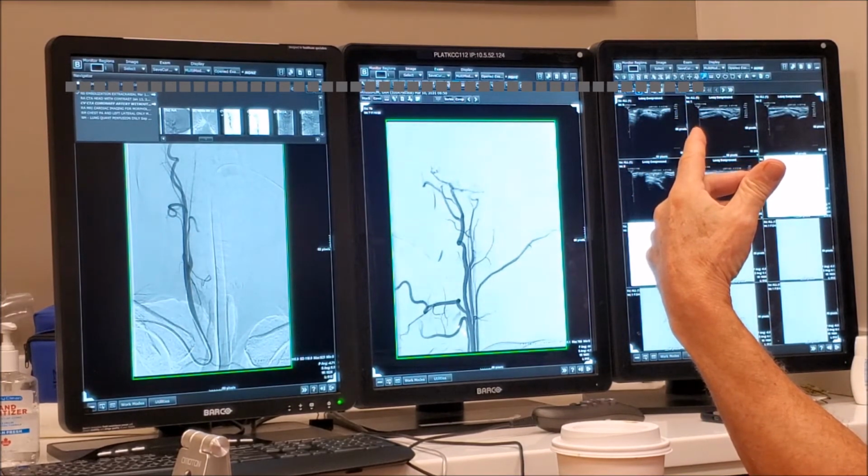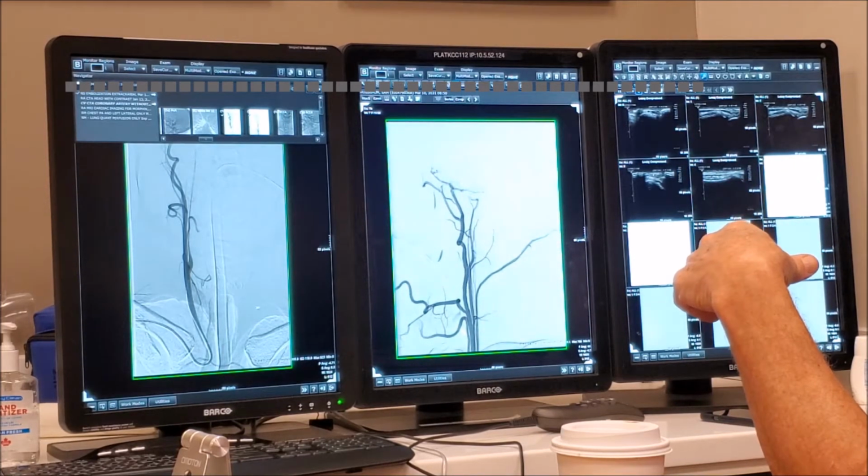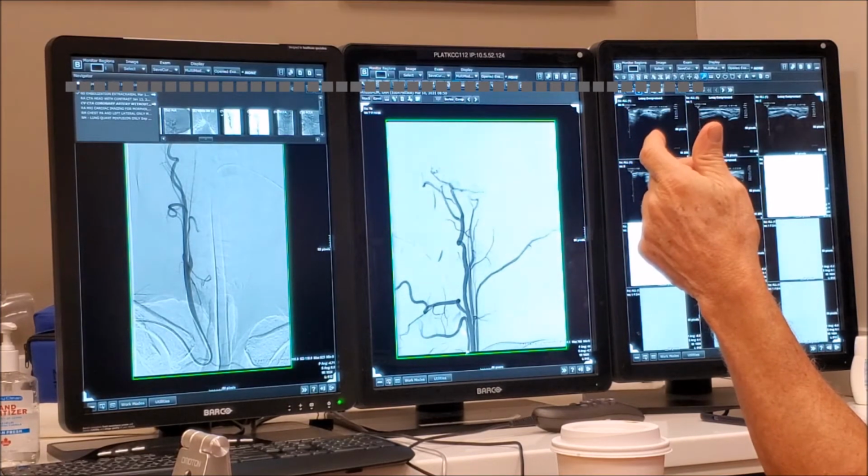And see one thing here, I see another one there. So this is the fascia. Now, look at this one, I would have taken a shot down below. Yeah, and all of them have a lower origin, it's fascinating. They come from a common origin. So that's right. So look at this, this coming.